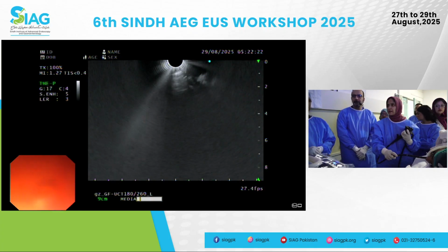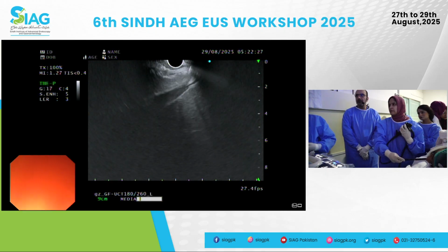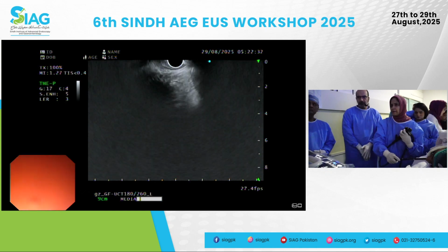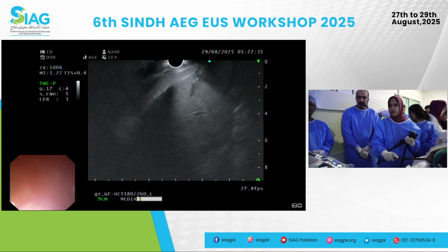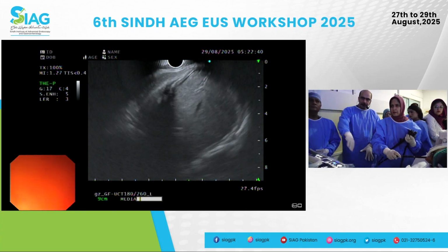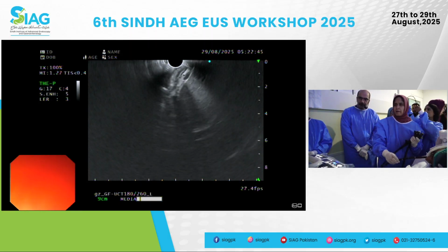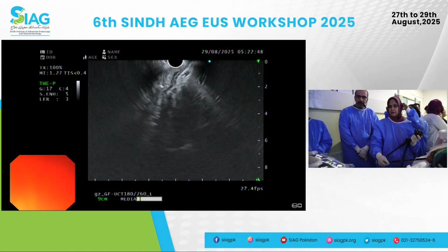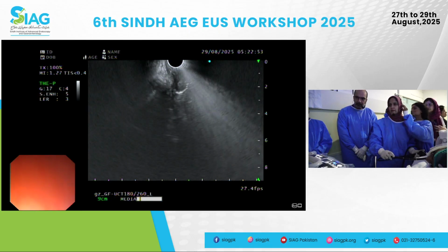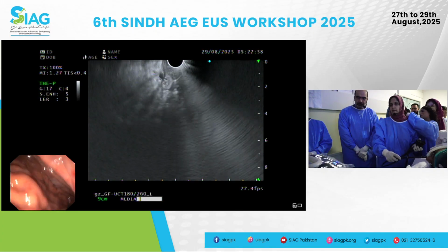Yes, sir. Okay, so let's just reset and go back in. So we're just at the GE junction, so look endoscopically, make sure you know where you are. Find your lumen endoscopically, okay? Go ahead and drop your left hand, so go counterclockwise. Keep going counterclockwise. There you go. Now advance a tiny bit. It's okay. You're there. Stop.